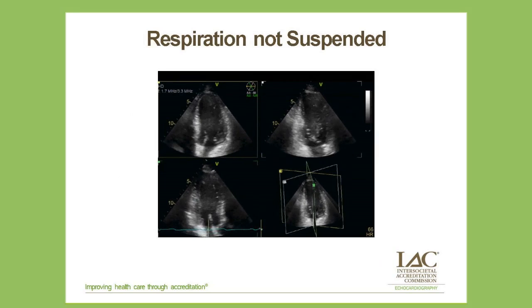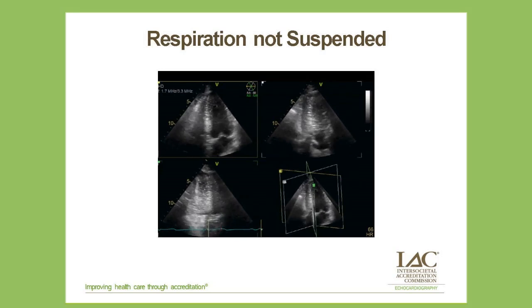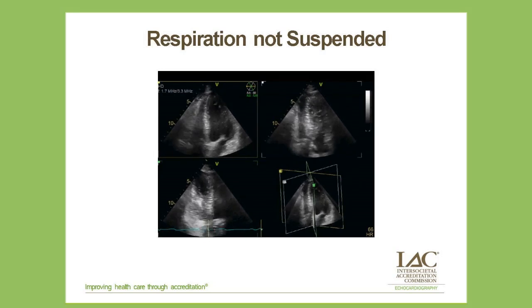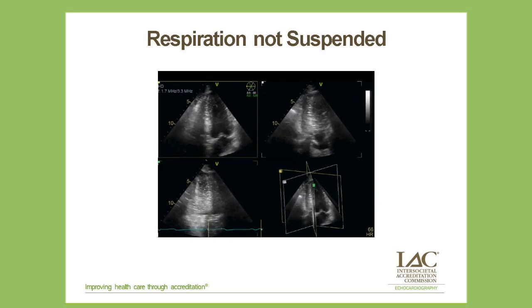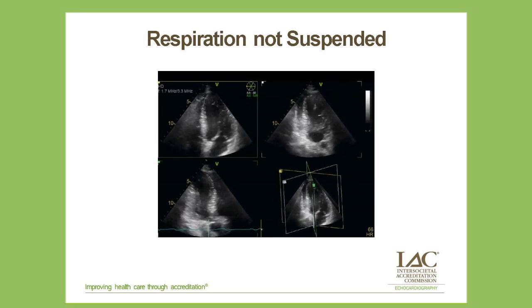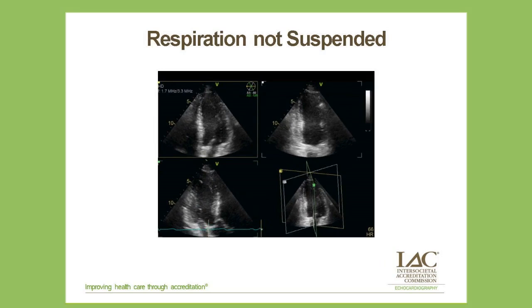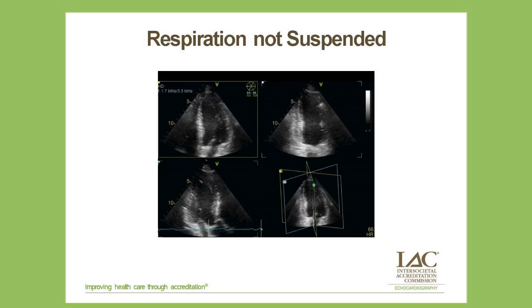And if you notice, you can see the heart kind of moving back and forth here. The four-chamber view, which is top left here, almost becomes an apical five-chamber view with a motion. And if you look to the right, that should be your apical two-chamber view, and that one changes as well and almost goes to an apical long-axis view. But look at the bottom left, the apical long-axis view there, how it doesn't stay open. The ventricle almost closes totally off.